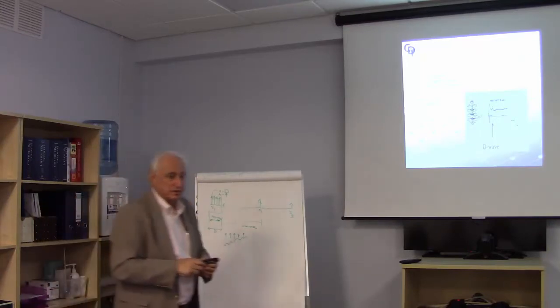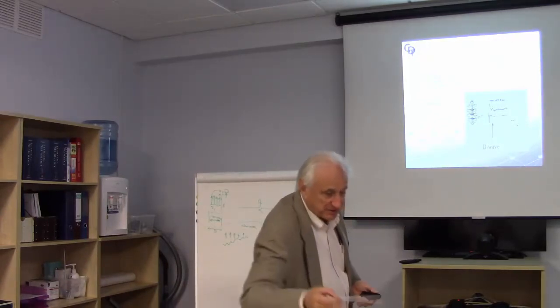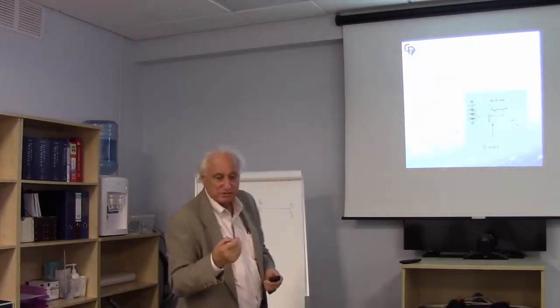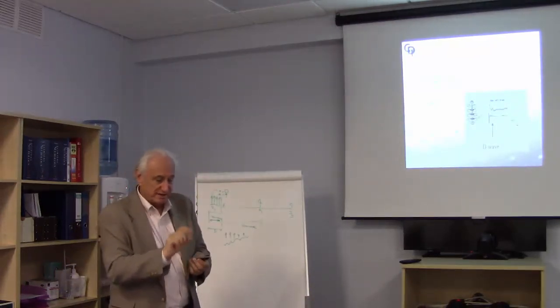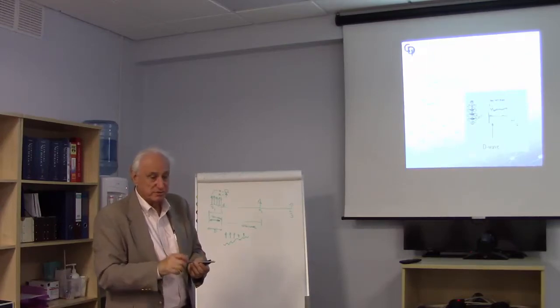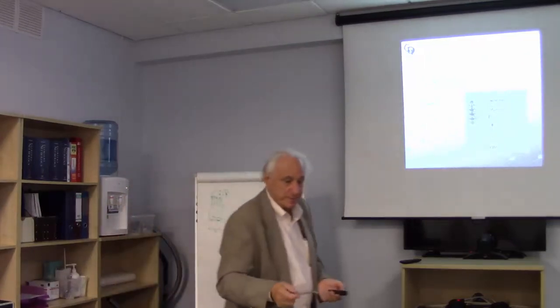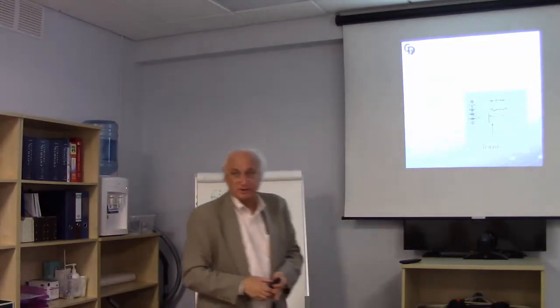Remember, we talked about the cord having the width of a pencil. You know, it's not a big thing. That's the size of the spinal cord. So the grids, when you slide them in, the contacts on the grids are as wide as the cord, so you can see both sides. And we think that makes for a good recording technique.